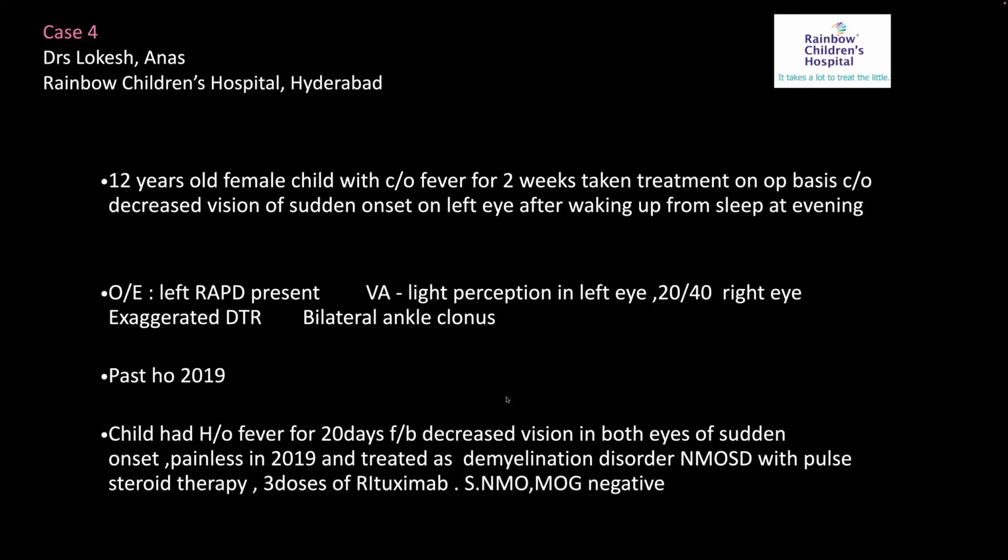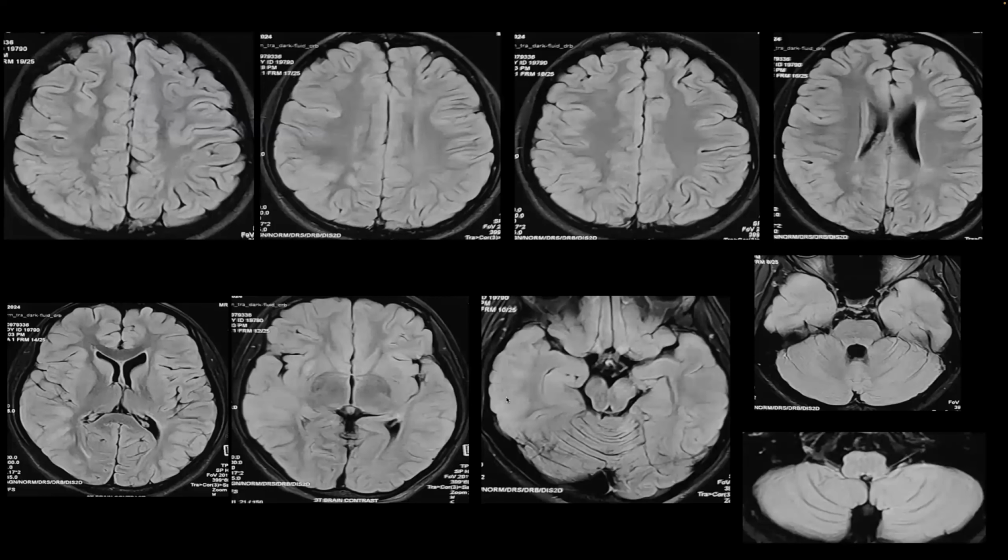Okay, so I have the recent MRI. I have only the films. These are non-contrast sequences, slightly degraded in quality, but you can appreciate there is some degree of cortical subcortical edematous changes in the bilateral frontal lobes, in the right parietal lobe, along the cingulate region. Some periventricular hyperintensities, anterior and posterior periventricular hyperintensities coming down along the inferior aspect. The basal ganglia appear to be relatively normal, thalami normal.